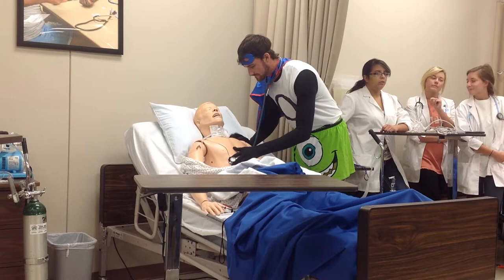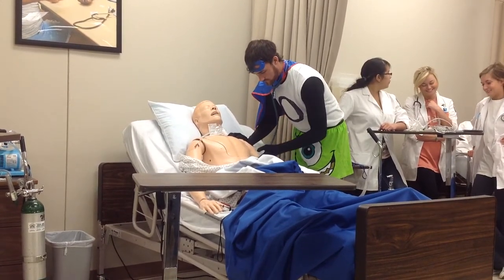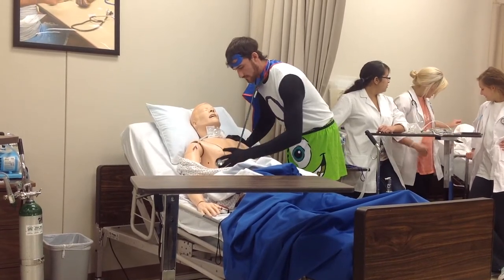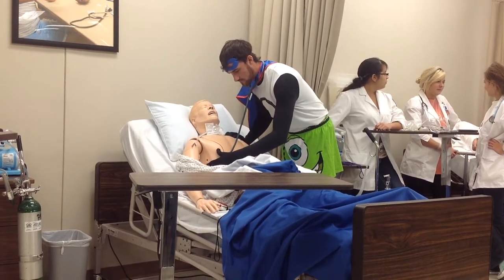Okay. Can you breathe deep for me? And again. One more time. And again. So now he's listening to the lateral sides.